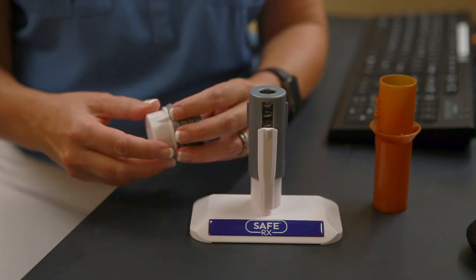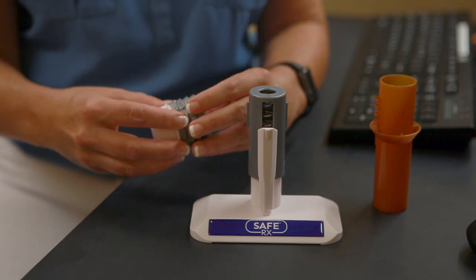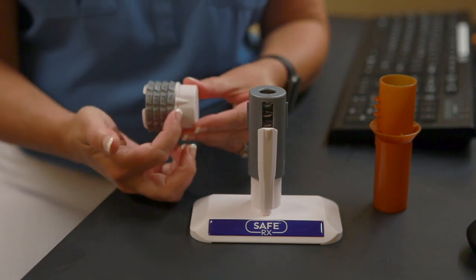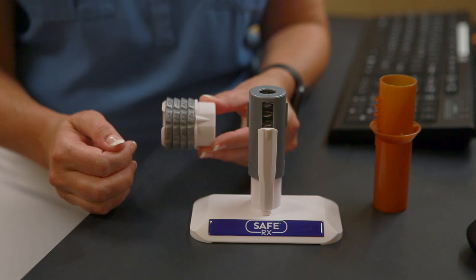You'll start by setting the number — I'm going to do this one easy at 1, 2, 3, 4. You turn the dials to line up on the arrow that you see on the cap, and it's going to go left to right on the cap, just like you were reading.